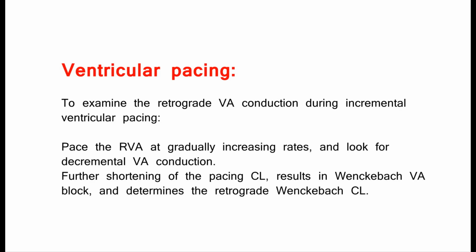Ventricular pacing. To examine the retrograde VA conduction during incremental ventricular pacing, pace the RVA at gradually increasing rates, and look for decremental VA conduction. Further shortening of the pacing CL results in Wenckebach VA block, and determines the retrograde Wenckebach CL.